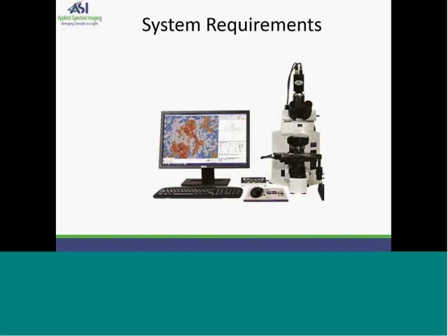Other labs may use the same automatic microscope for both bright field and FISH analysis. In this case, TissueMatch is installed on this single automatic system. The pathologist runs the application for the bright field work, while the FISH technician runs the application at a different time for the fluorescent work.